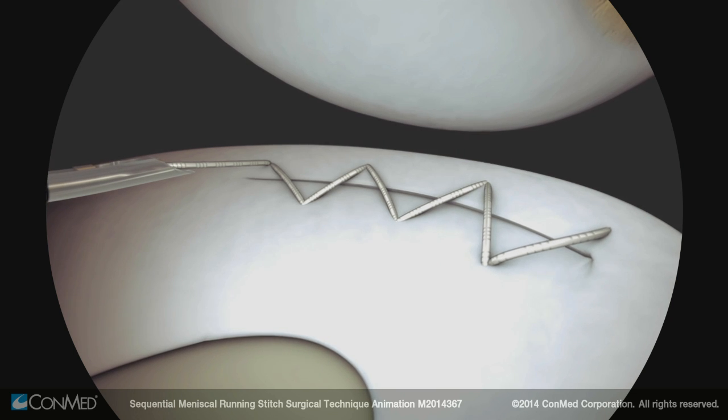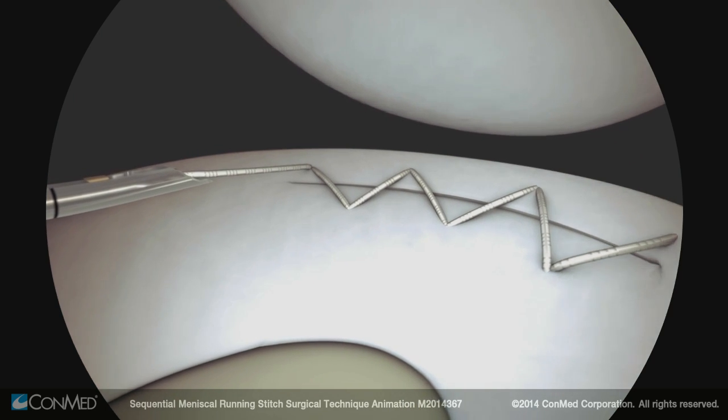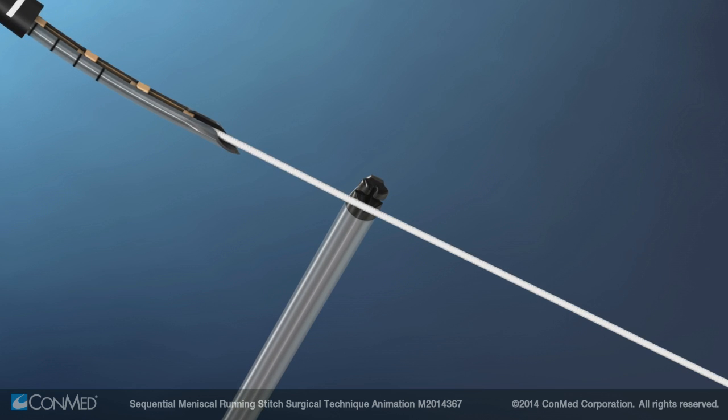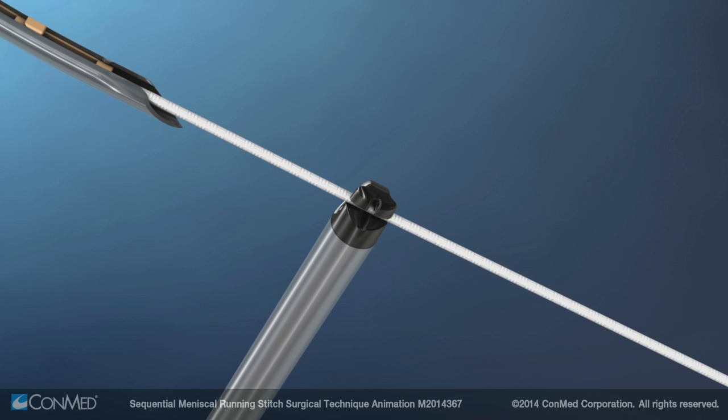After the last stitch, remove the sequent meniscal repair device from the joint. Load the suture cutter onto the suture outside of the joint. Holding the cutter perpendicular and the suture taut, load the suture into the cutter slot.